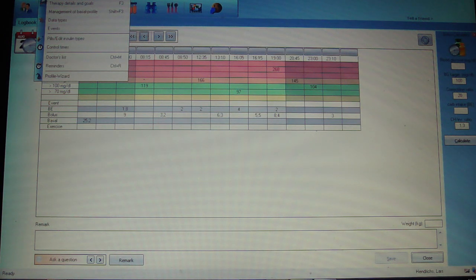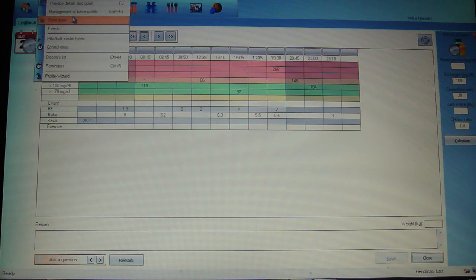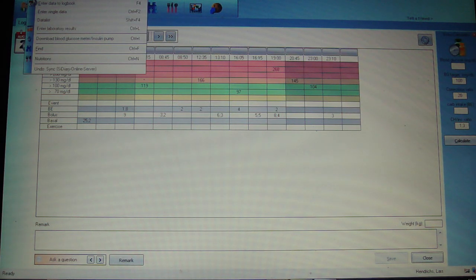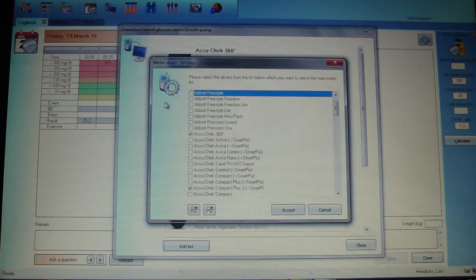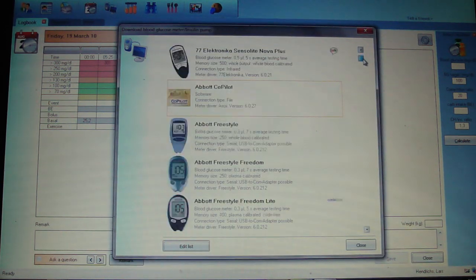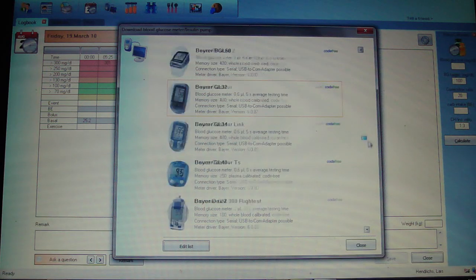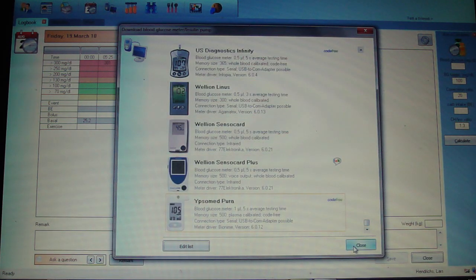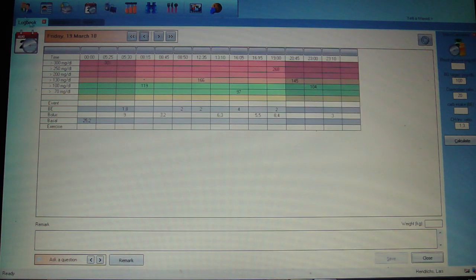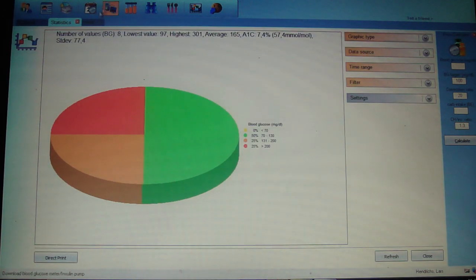Normally when you connect your pump or blood sugar device to the computer, it automatically reads out the values for most devices. But you can also manually read out the data by going to Download and selecting from a whole range of supported devices. Once you select the device, the data are transferred. You also have the option to view statistics from your current values.